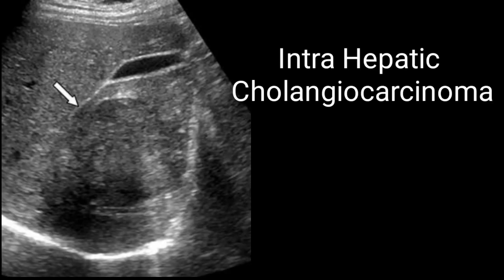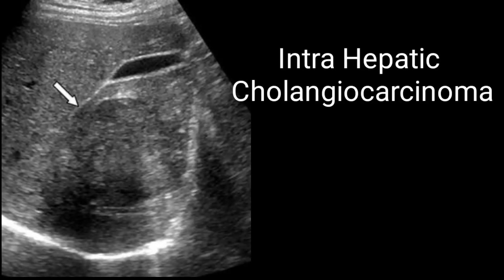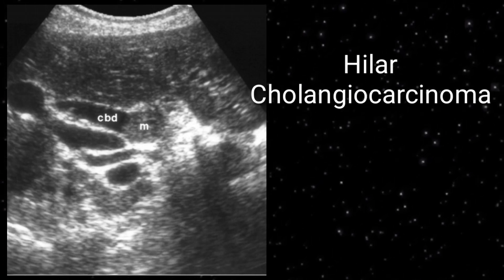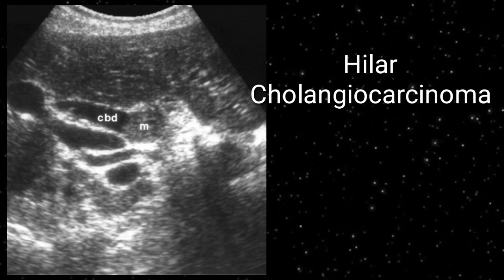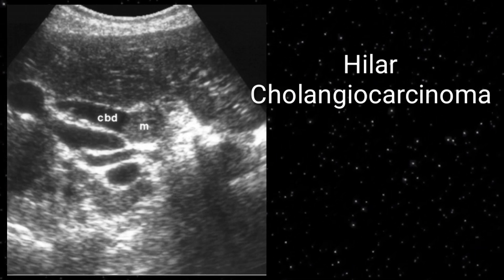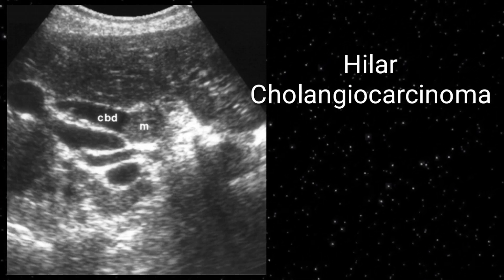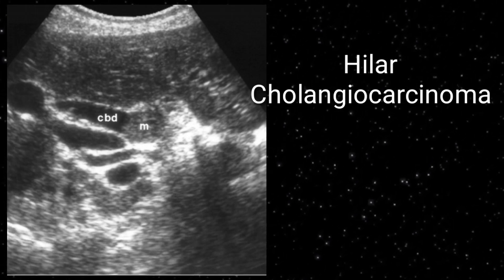On this image, you can appreciate a well-defined hypoechoic round mass in the right lobe of the liver — this is an example of intrahepatic cholangiocarcinoma. To differentiate from hepatoma or hepatocellular carcinoma, look for biliary channel dilatation: if the biliary channels are dilated, it is likely cholangiocarcinoma; if not dilated, consider hepatoma or HCC. Another classical example shows a well-defined hypoechoic mass at the hilum of the liver — this would be hilar cholangiocarcinoma. Measure the size, mention the echotexture and location, and report it as a hilar hypoechoic mass, likely cholangiocarcinoma.